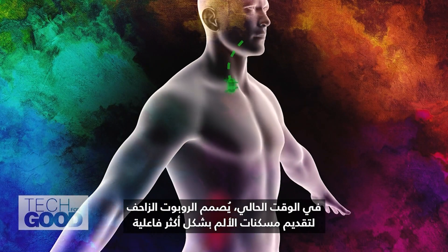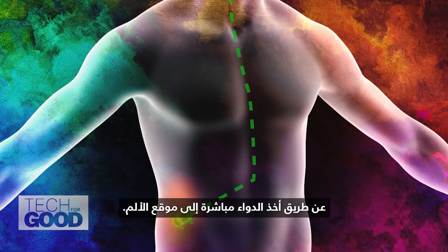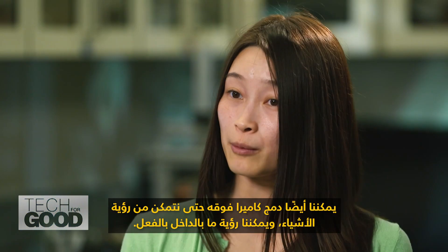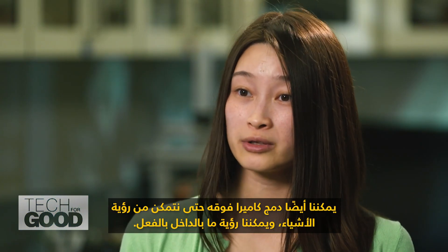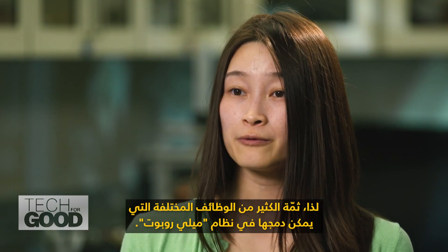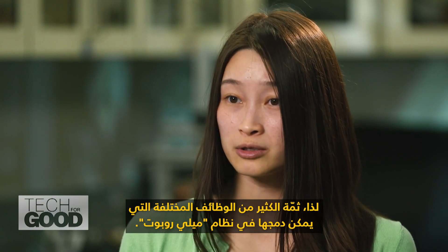Right now, the crawler robot is being designed to deliver pain medicines more effectively by taking the drug directly to the site of the pain. We could also integrate a camera on top of it so that we can see what's actually inside. There are a lot of different functionalities that can be integrated into the milli robot system.